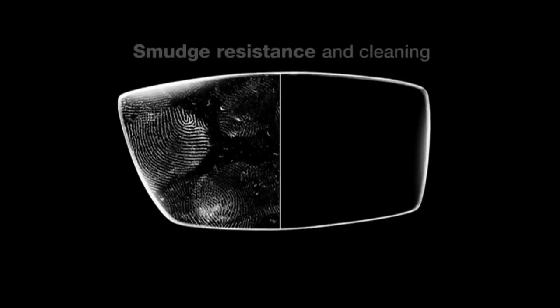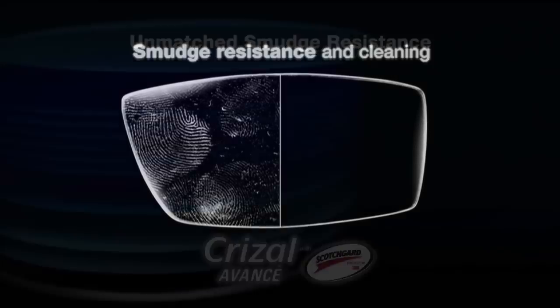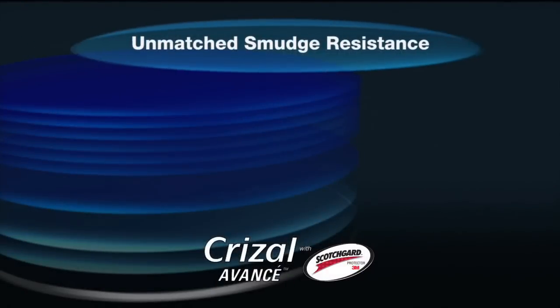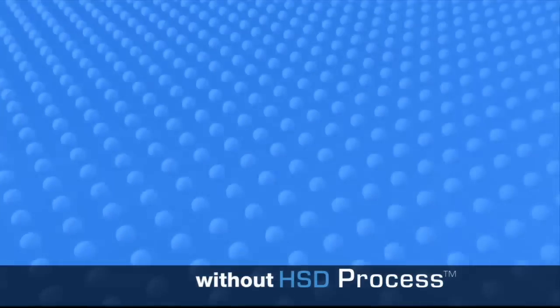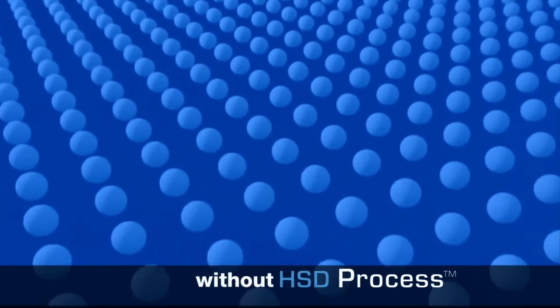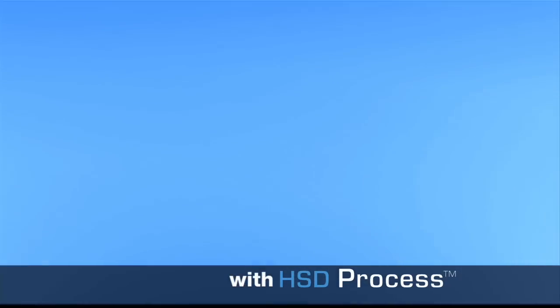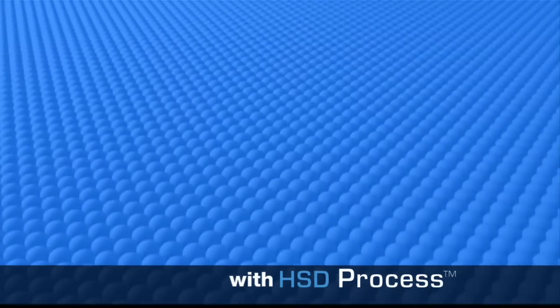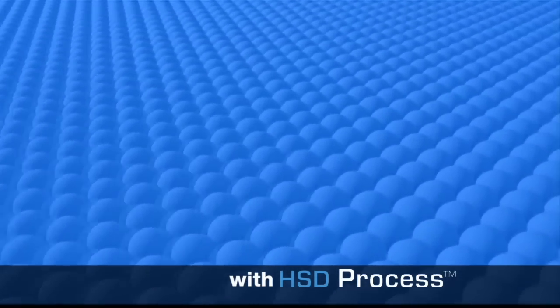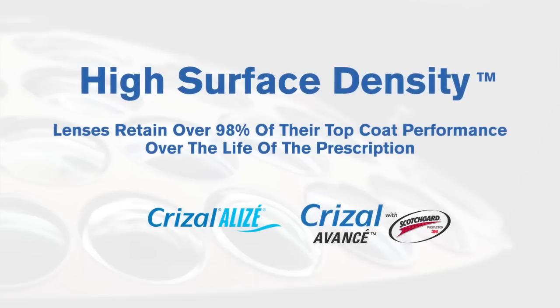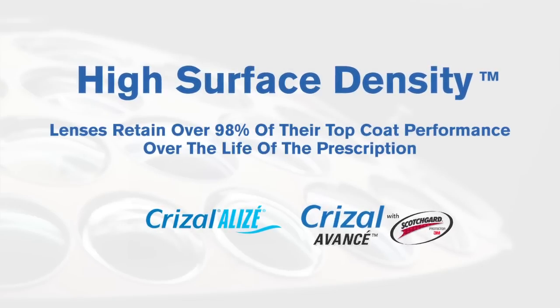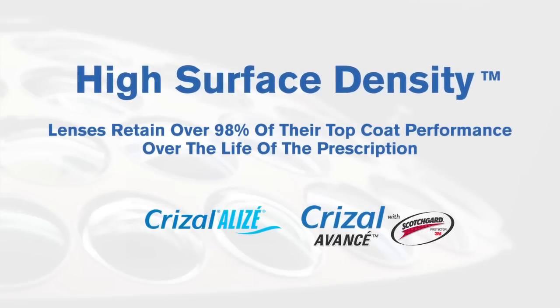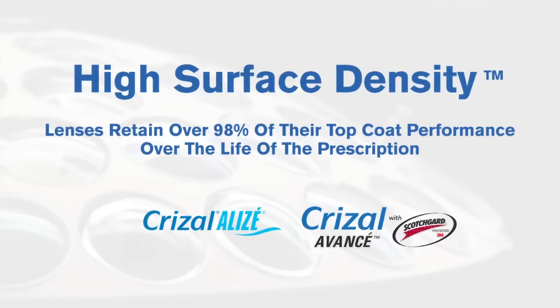The slickest super hydrophobic top coat in the industry is achieved by the high surface density process, which tightly packs the top coat molecules so nothing can stick to the surface. This allows the lens to resist dirt, smudges and water. Furthermore, the HSD process allows the lens to retain over 98% of its top coat performance over the life of the prescription.